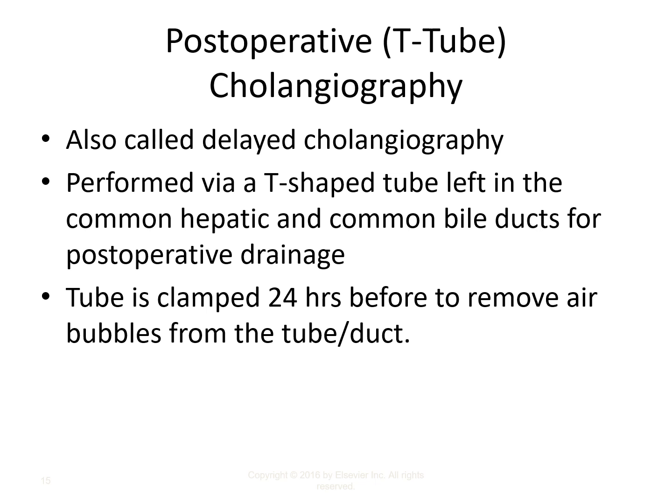Okay. For a T-tube cholangiogram, again, this is typically post-operative, and it's the surgeon that places the T-shaped drain tube after removing the gallbladder.